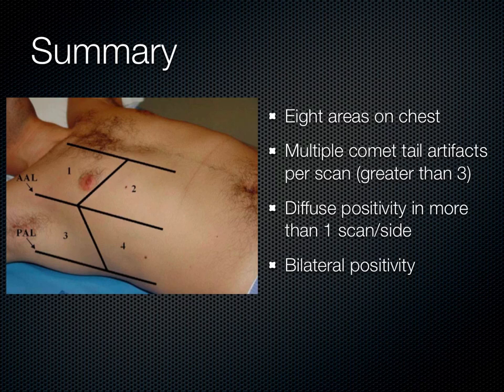So to summarize, the pulmonary ultrasound is not new. It's just newly appreciated, and we're adapting it now to appreciate pulmonary edema, pneumothorax, pleural effusions, consolidations, and multiple other etiologies to help us guide our therapies and get the correct therapy to the patient in real time.